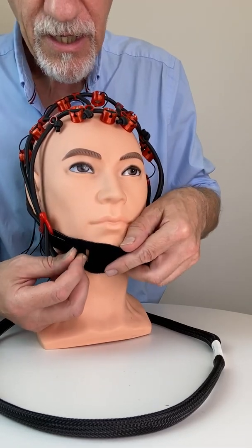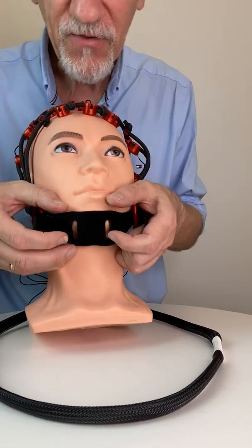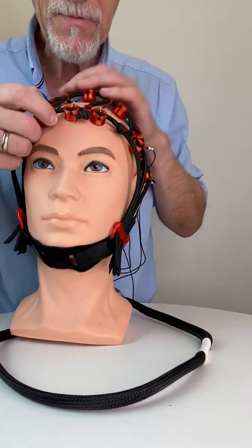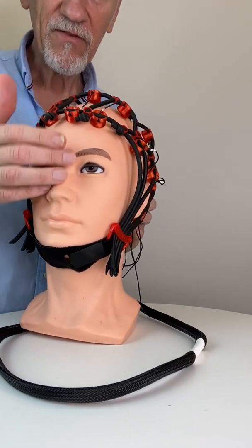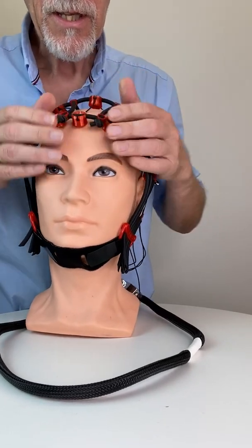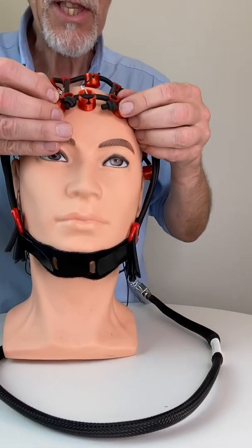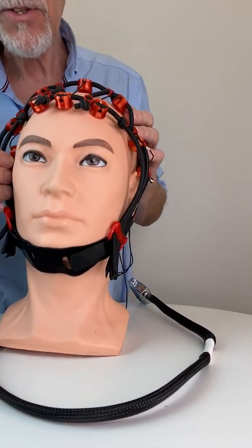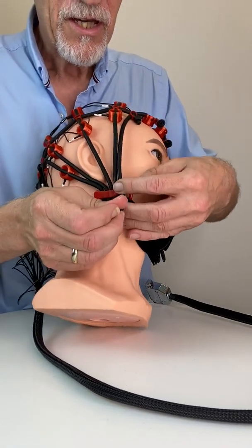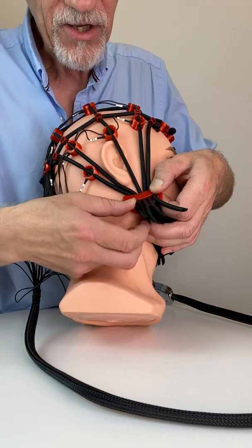Now you can pull here a little bit more if you like so that it's comfortable — but not too much. Make sure that this is the ground electrode. It's in the middle of the line of the nose. Look for the midline and make sure that this line is kind of straight. If it doesn't do that you can always correct it. Now we see there are a lot of loose tubes and we try to correct this and pull gently on those tubes so that we get more pressure on the electrode holders.